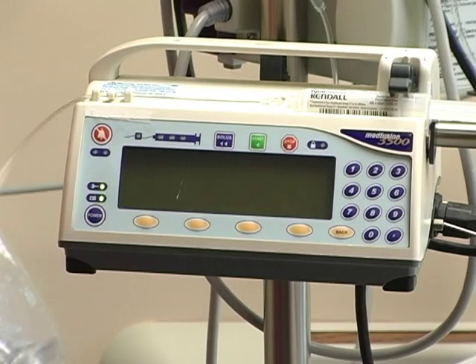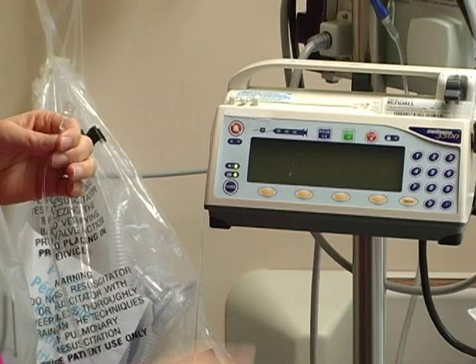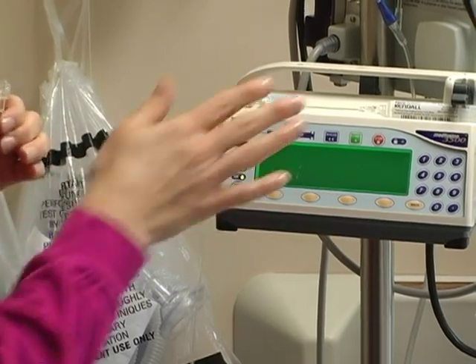You're then going to want to connect your patient after cleaning the hub for 15 seconds with your alcohol, and power the pump on. It does take a few minutes for the pump to do the self-checks.